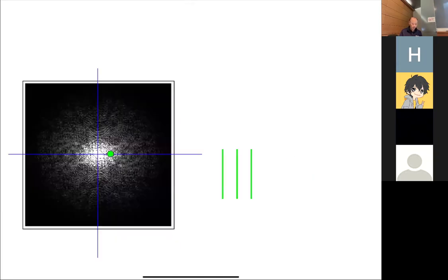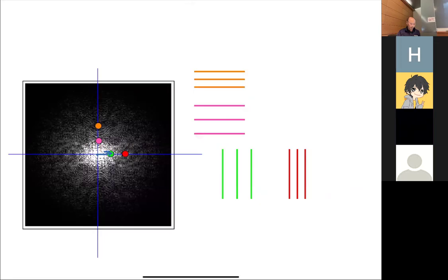Alright. So here, just showing if I'm in this K-space, imagine I'm drawing here. The perpendicular is obviously this. And then if I go farther out in K-space, the spacing period just decreases. If I go along here, then the perpendiculars are this way. I go farther out, the spacing decreases. And if I go diagonally, then I imagine drawing a vector out this way, I draw the perpendiculars to it, I get that variation. Okay.